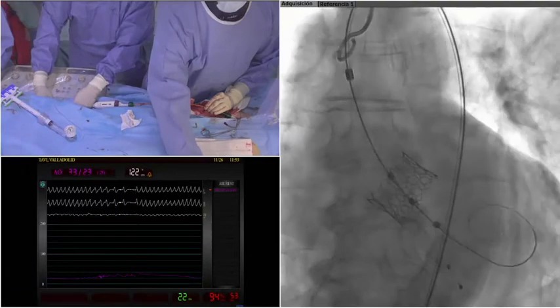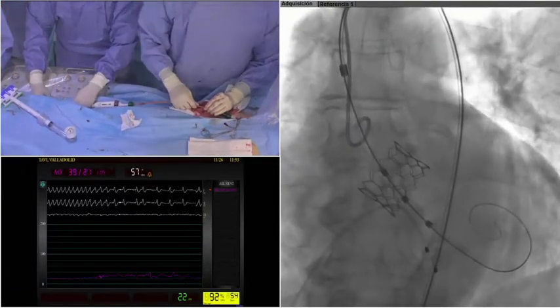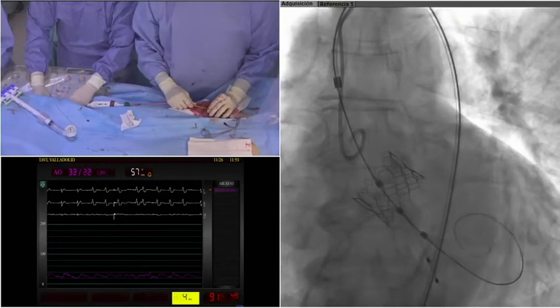Since we crossed the valve, the patient was a bit hypotensive. Sorry, we have to speed up. Noradrenaline, a 10. So let's see the recovery of the pressures. We are going to take out the balloon.